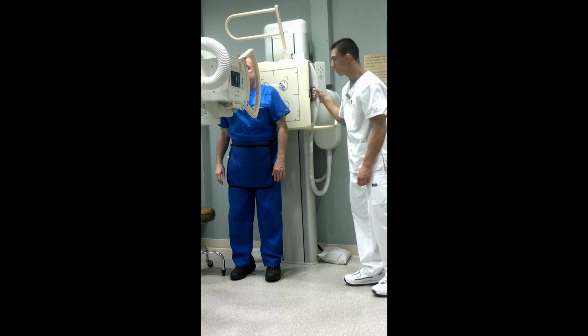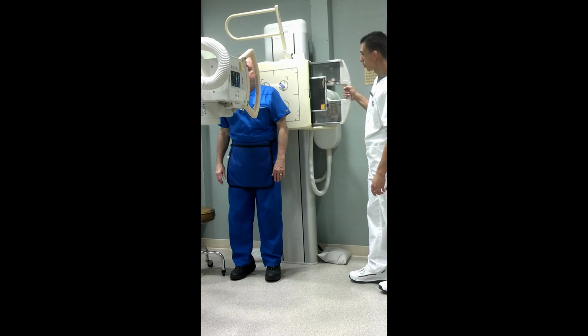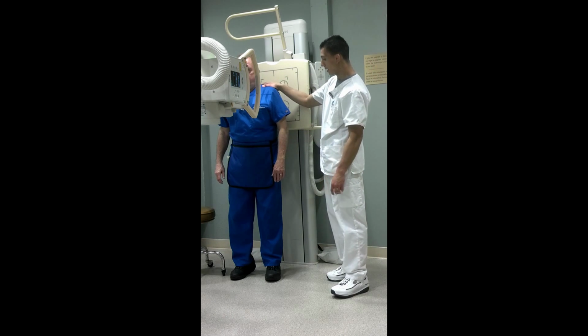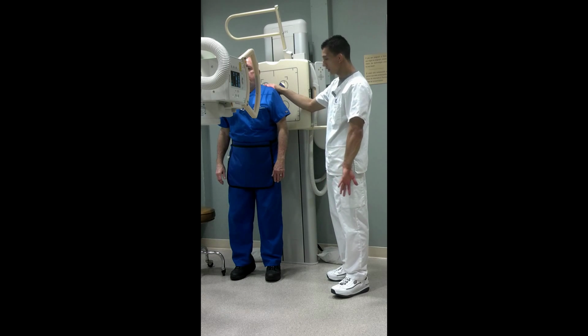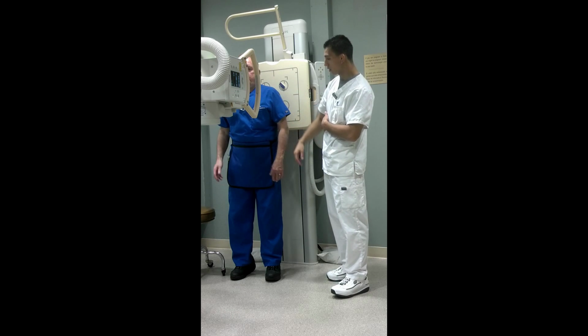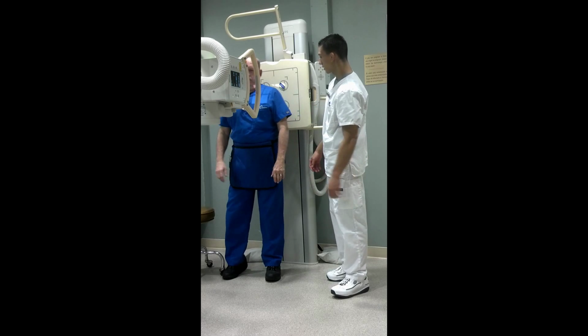So after we're done shooting that, I will grab the cassette and I will run it to the reader. I'll come back and we'll set up for the internal rotation one. And so the only difference for the internal rotation is that I'm going to ask the patient to put their hand across their chest here, just like that. You can do it either way, but a lot of times if the patient has an injured shoulder, it's a lot easier for them to just bring their arm across their chest. So go ahead and bring that across the chest there.